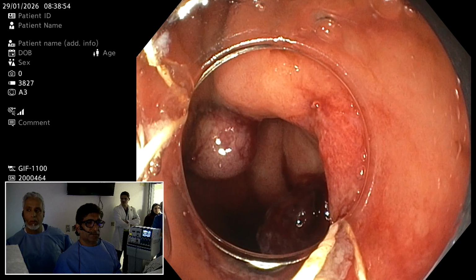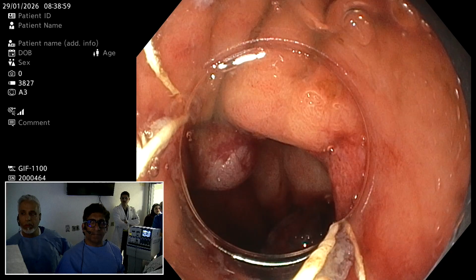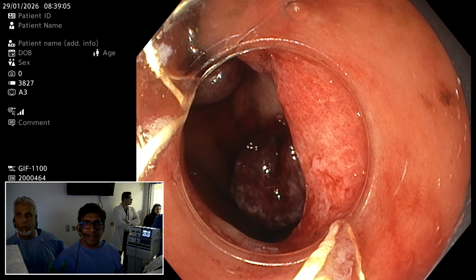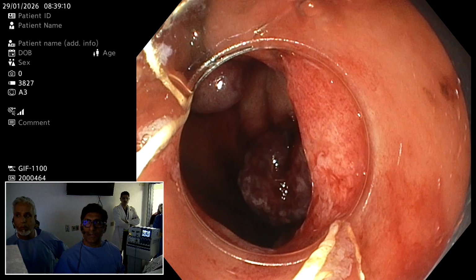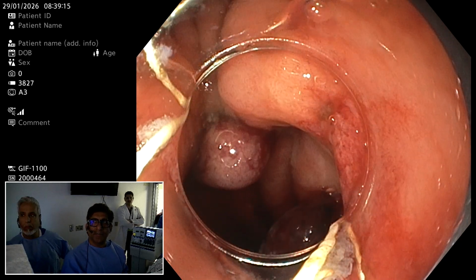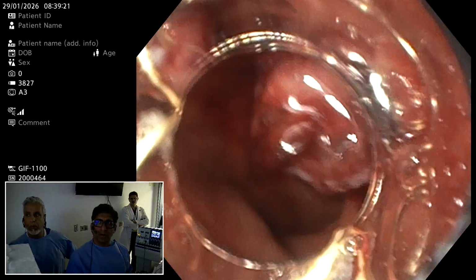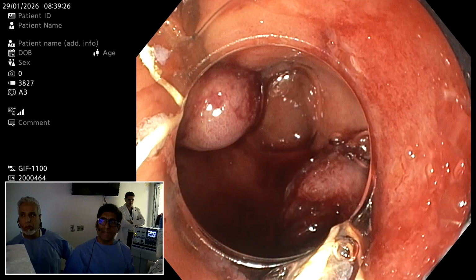This is also the same. It becomes ischemic, and then you will find after 2 months nothing is there. Nobody has seen it serially, but we call our patients after 2 months and everything is gone. We do DOTA scan, we do check endoscopy, and we are able to remove the majority of these lesions without any long-term problems, and there is much literature available for band ligation without resection.